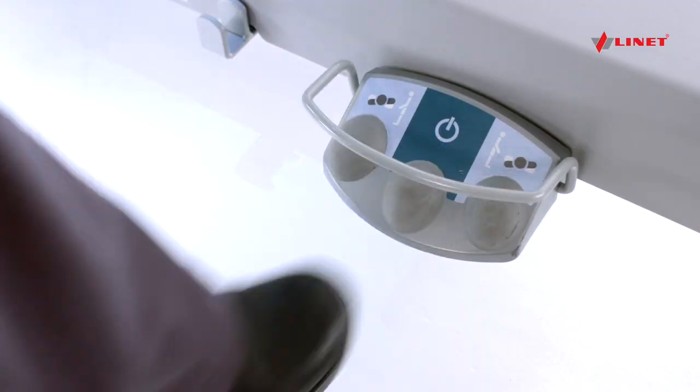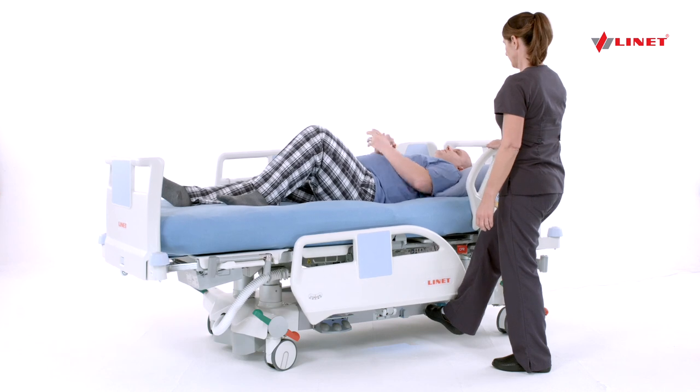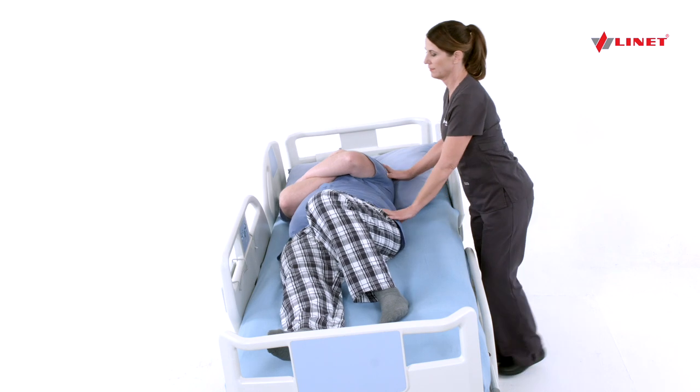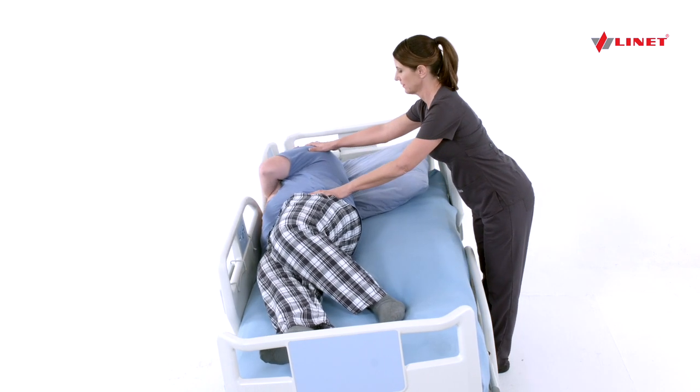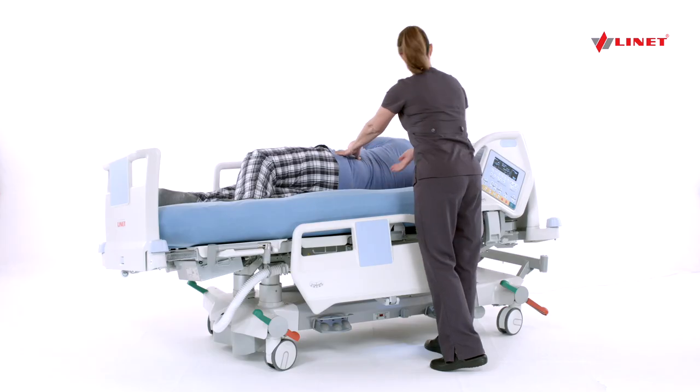Press the green go button, then use the left foot pedal to turn the patient away from you. Tilt the bed away from the caregiver approximately 5 to 8 degrees, or just until the patient's weight shifts, then turn the patient away from the caregiver to access or complete the procedure.